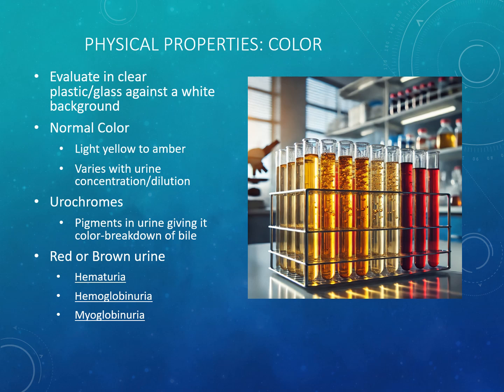Hemoglobinuria is when we have hemoglobin specifically in the urine. So, not just blood, but hemoglobin specifically. This indicates that there is intravascular hemolysis with subsequent filtration of the hemoglobin into the tubules. The supernatant appears red, and the plasma color is pink to red for the blood.